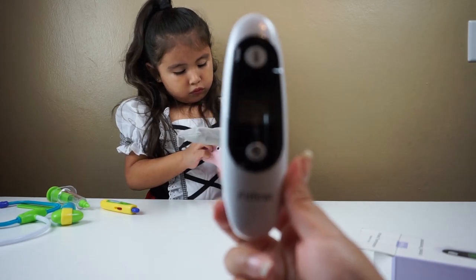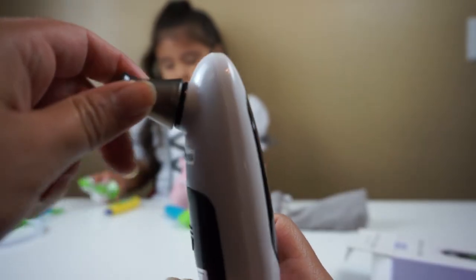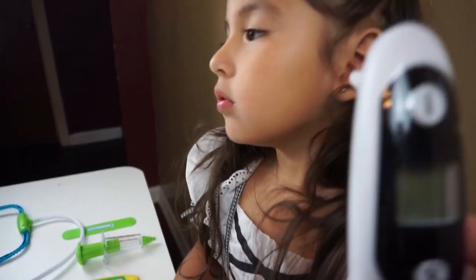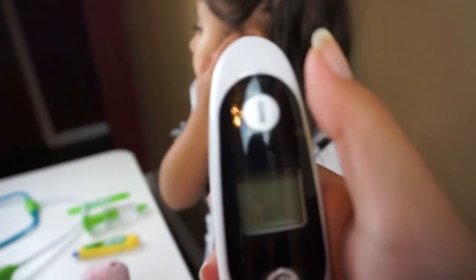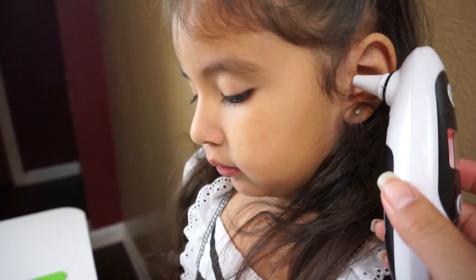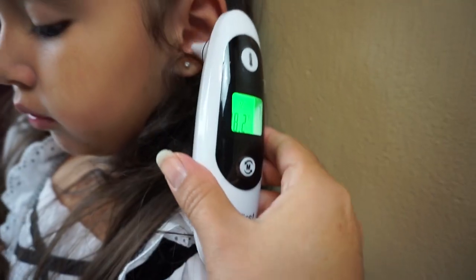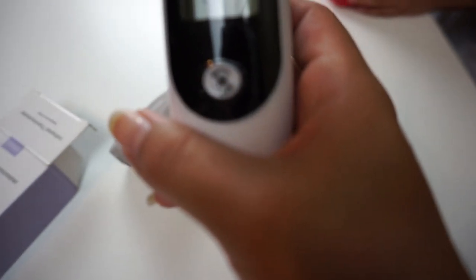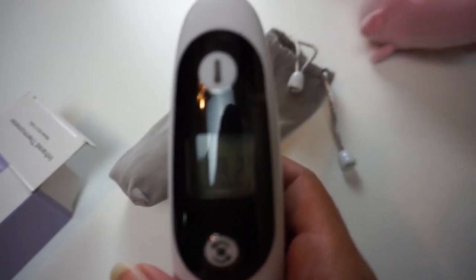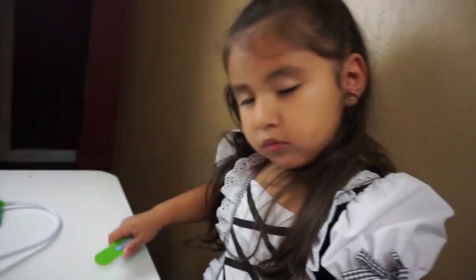I will check Allie's temperature. I'll check her temperature by pressing this button right here. I'm gonna put it on her ear. So it says 98.2. Oh it says 98.2, so she's good. So you don't have a temperature, Allie.